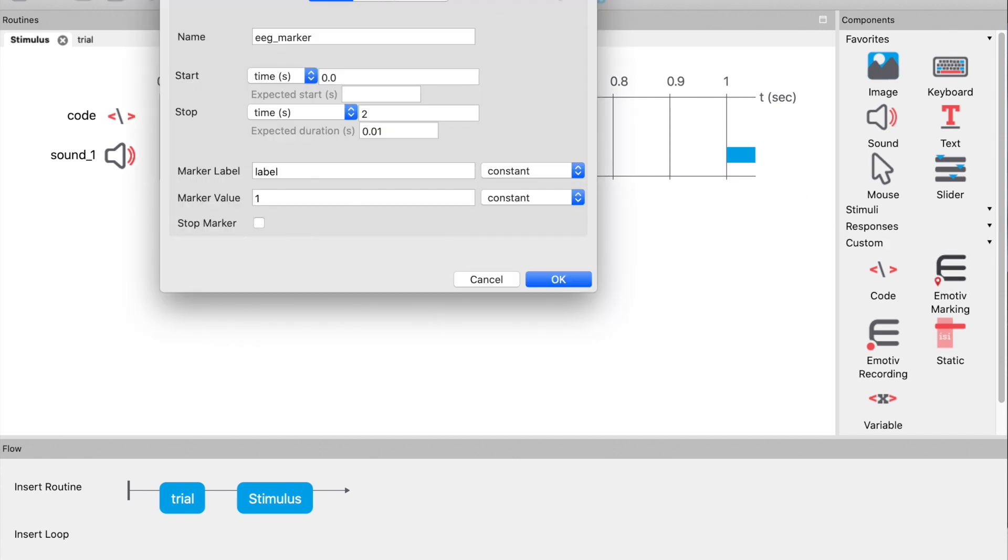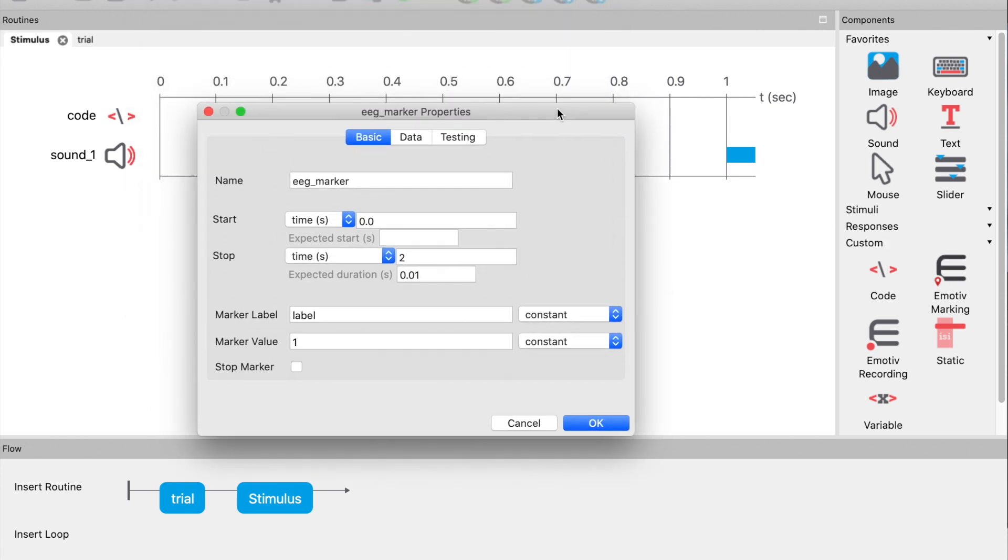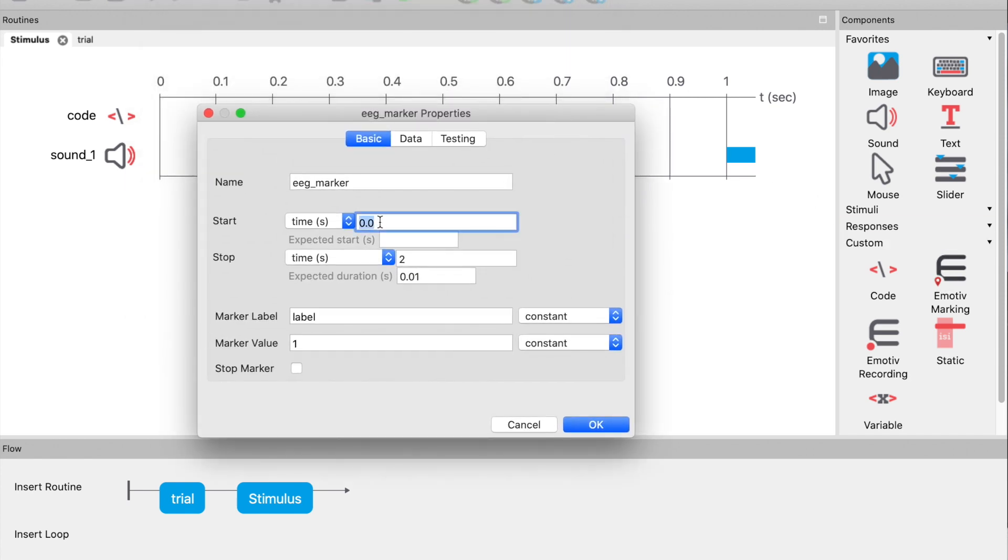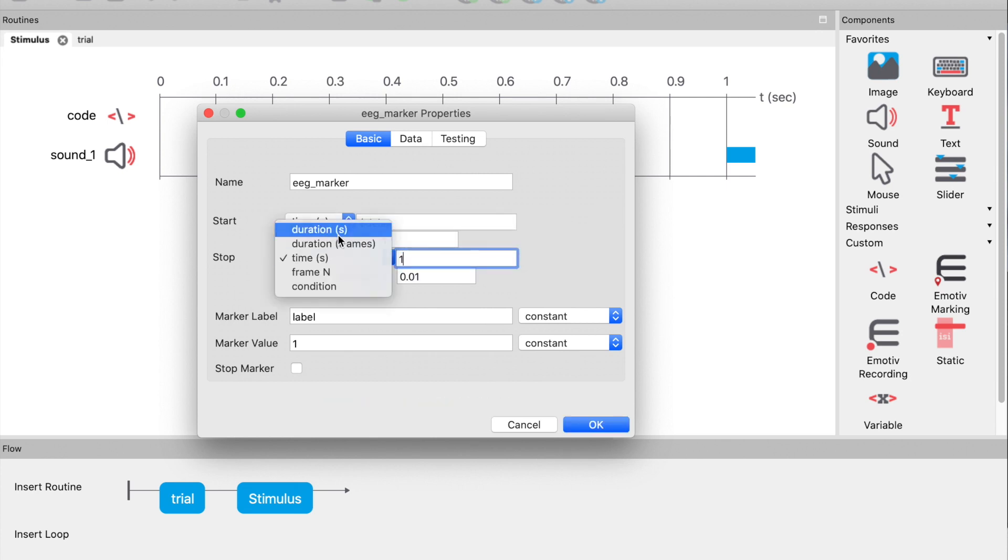Finally, let's add the EMOTIV marking component. Set the start time to $delay so the marker is added at the same time as the tone is played, and set the duration to be 1 second. This will just add some time between the stimuli.